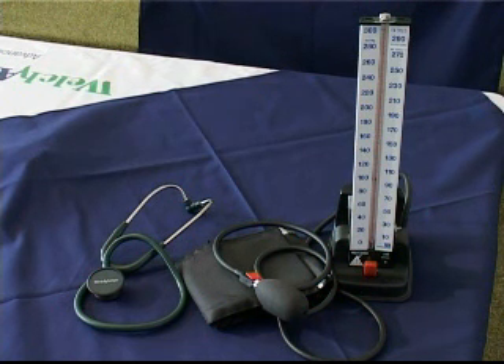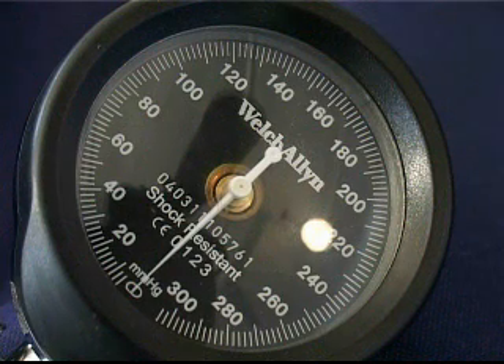A sphygmomanometer with a stethoscope is used to measure the systolic and diastolic blood pressure of a patient in the course of a physical examination. The blood pressure is expressed in millimeters of mercury.